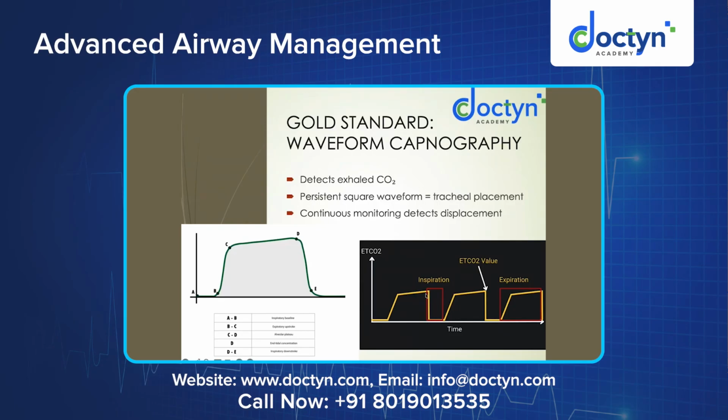During inspiration, the carbon dioxide will not be there, while we are inhaling. It will be mainly oxygen. So that's why the amount of carbon dioxide decreases. Then during exhalation, the carbon dioxide collected from the deoxygenated blood is picked up in the exhaled air. So slowly there is a gradual increase in the CO2. Then it plateaus and then again it decreases. So this is what confirms the tidal volume or the ventilation. So that's why a minimum of 6 of these waveforms are required to confirm endotracheal intubation.